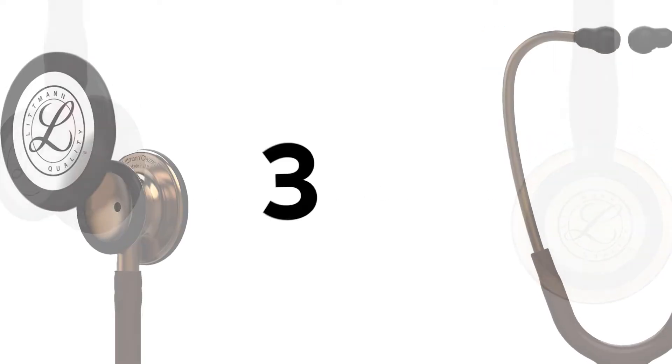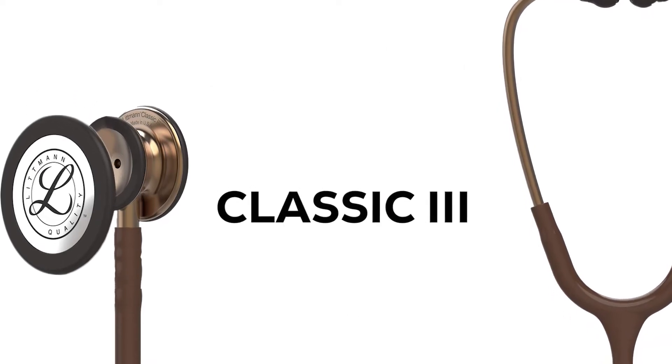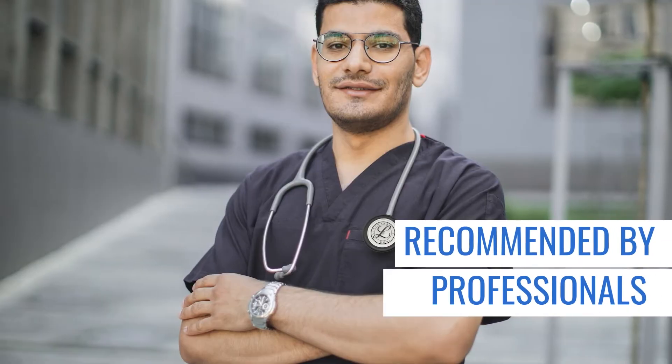Next in the list is the 3M Littmann Classic III Monitoring Stethoscope. If you ask other medical practitioners for a recommendation, they'll most likely say the Littmann Classic III. True enough, it's a worthy investment for students in a non-critical care environment.